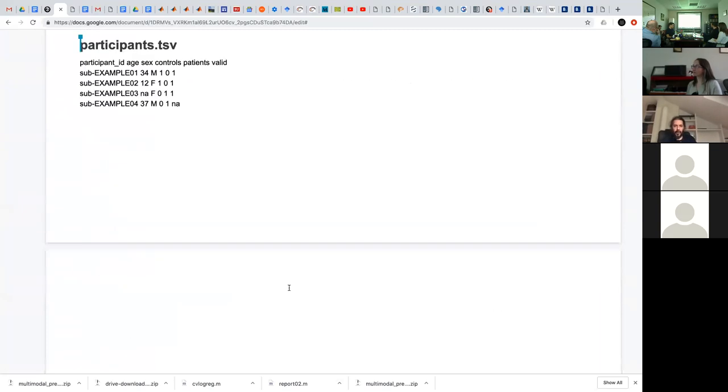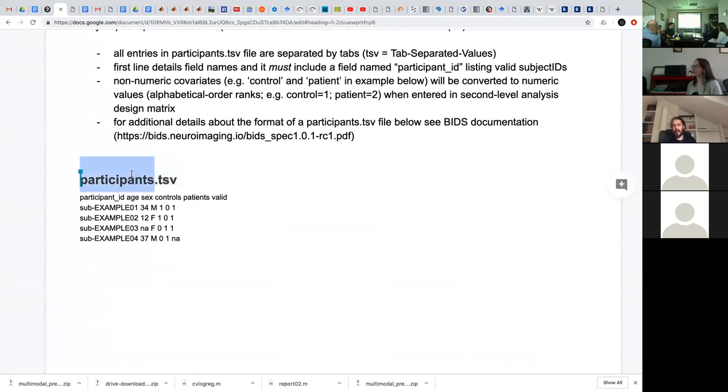Okay, so coming back to the participants TSV, does it make sense? I know that you guys had questions about this, how to specify different control groups and things like that. Is that clear now, or do you have any particular questions that you want to go into?